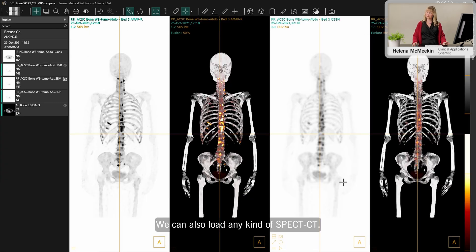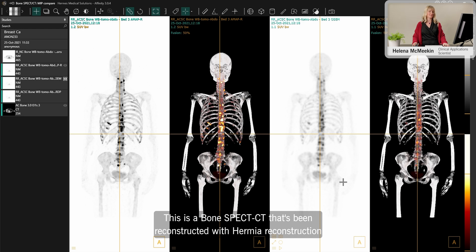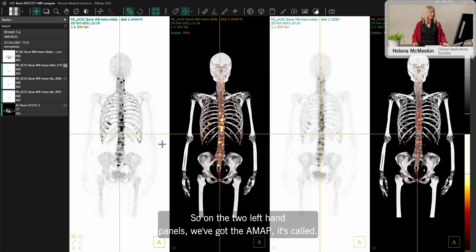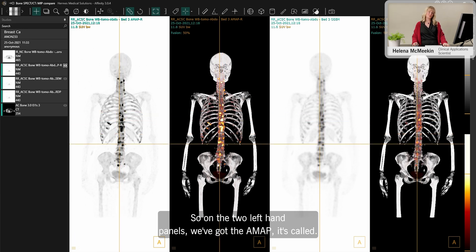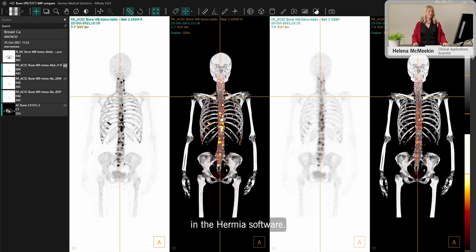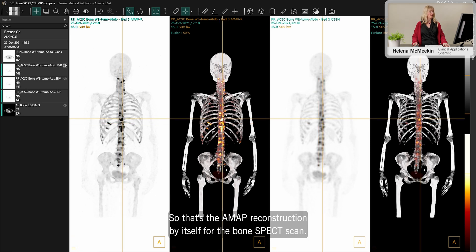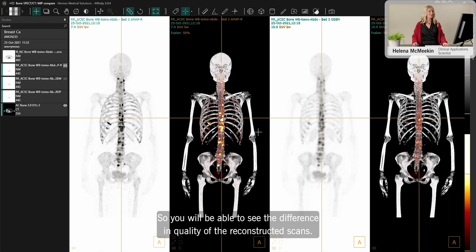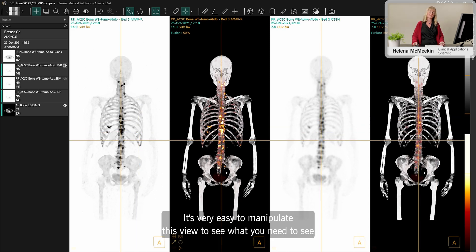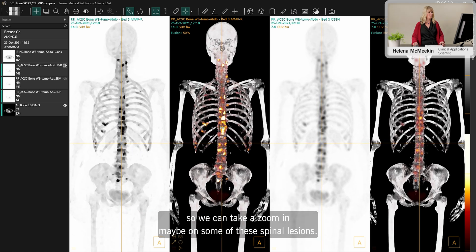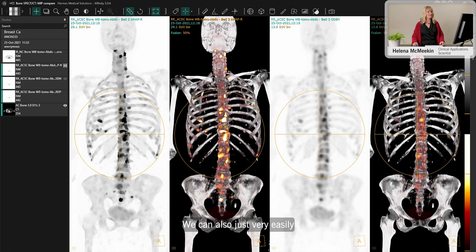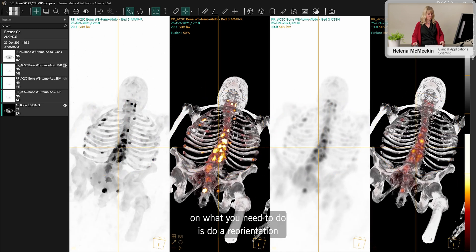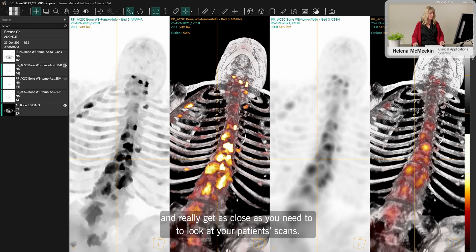We can also load bone SPECT CT — this is a bone SPECT CT reconstructed with Hermia reconstruction, also showing the CT volume render. On the two left panels we have the a-map (using the CT to guide reconstruction), and a fusion view with the CT, compared against a standard OSEM reconstruction so you can see the quality difference. It's very easy to zoom in on spinal lesions, rotate the view, and reorient to get as close as needed to examine your patient scan.